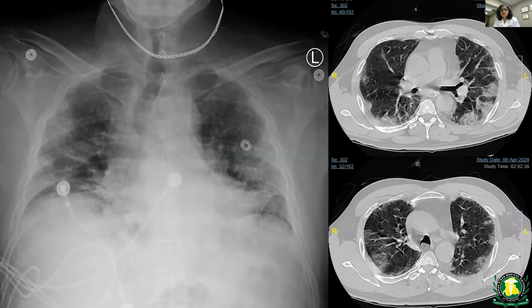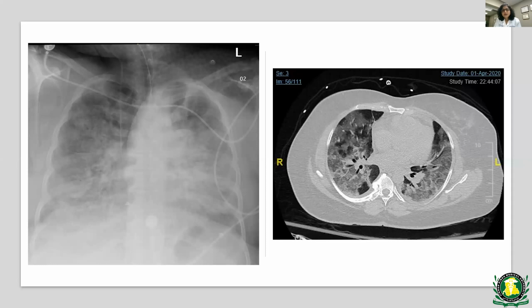Finally, I'm going to finish off with these two patients. One is the L-type patient. As you can see, the infiltrates here are in the periphery of the lung. And this is the H phenotype patient that had ARDS-like lungs.